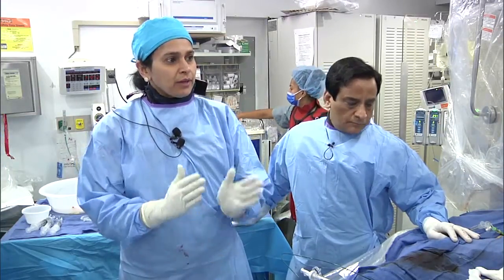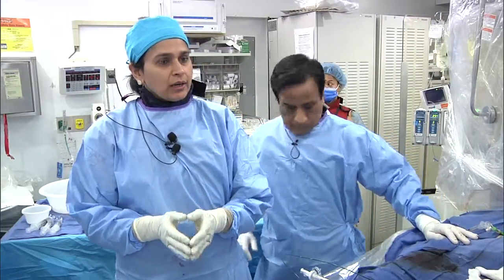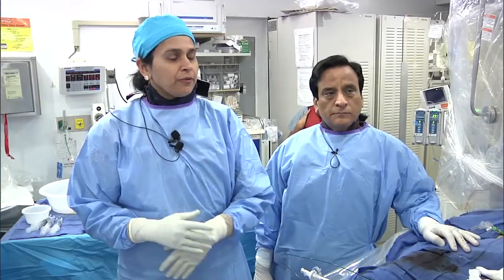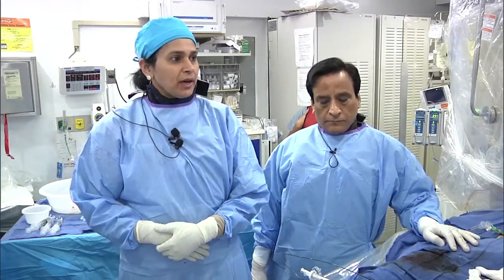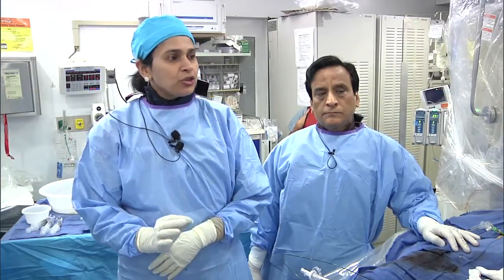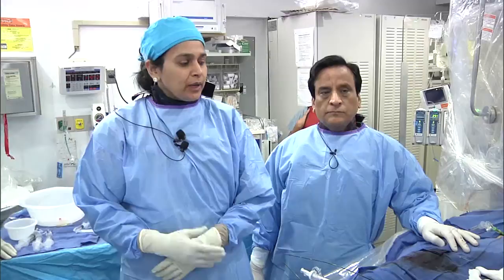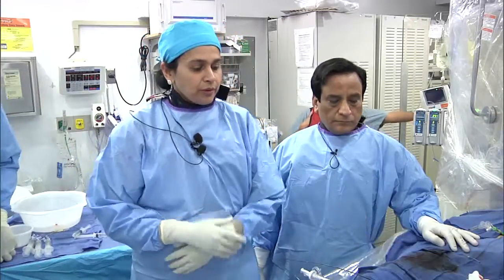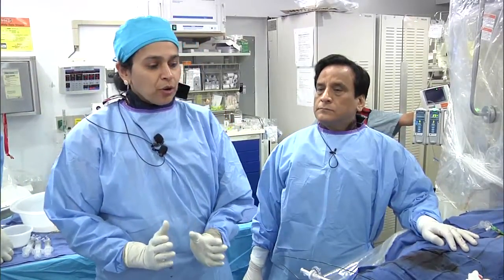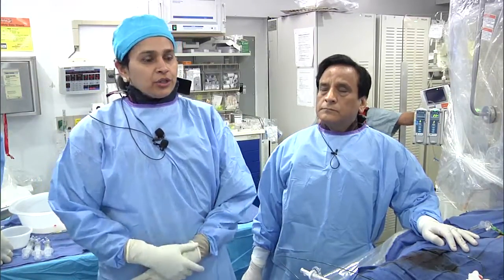Otherwise, like I showed you here, you have a nice entry point with a conical CTO starting like a cone. In that situation, you can either start with Miracle or, if people are used to Pilot wires, start with the Pilot wire, but something which is not a tapered tip, just for drilling. Again, same 1 to 2 minutes, you know that this is not progressing anywhere, go to your next wire, which could be either Confianza, or if you are used to the Progress family, you can use the Progress family. But essentially, you are not using more than two or three wires, so the wire escalation is faster, just in a couple of minutes.